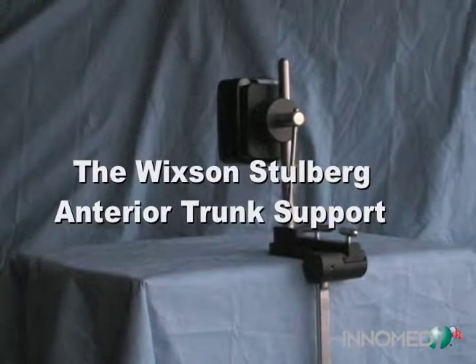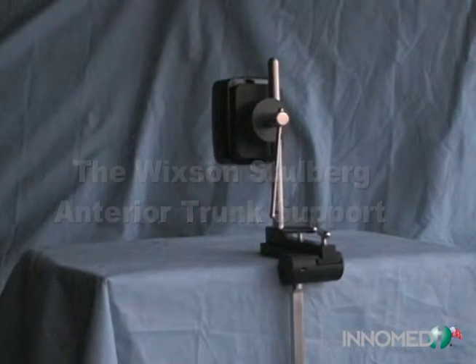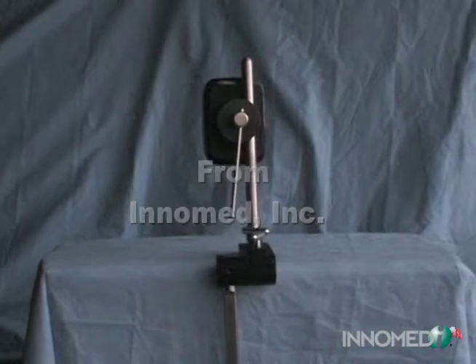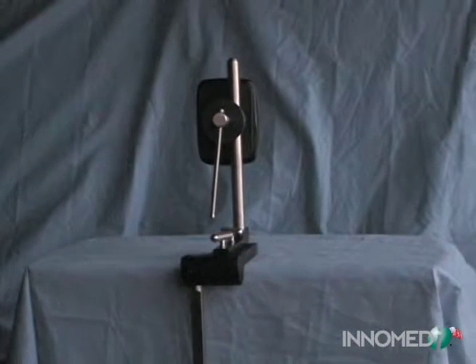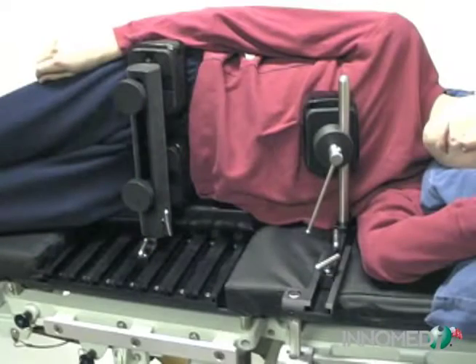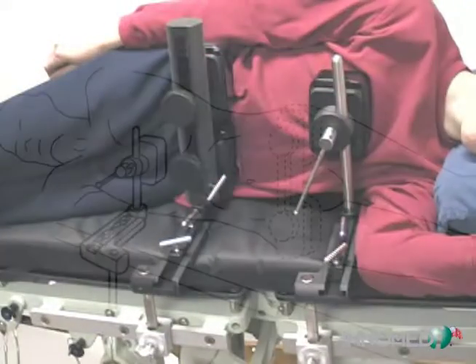The Wixson Stulberg anterior trunk support helps prevent the chest and shoulders from slumping forward during surgery. It is compatible with the Wixson hip positioner and the Stulberg hip positioner from Innomed, and may also be utilized in surgeries where the patient would be positioned on their side.